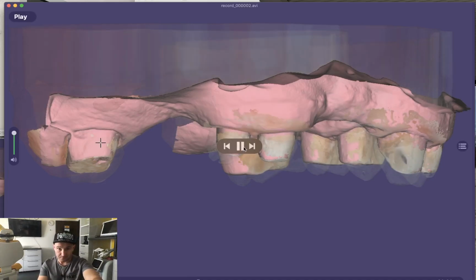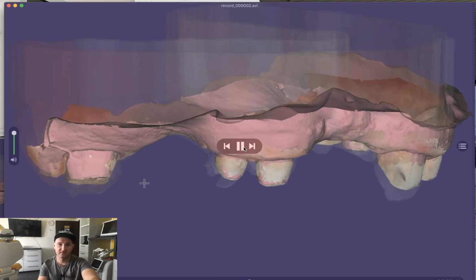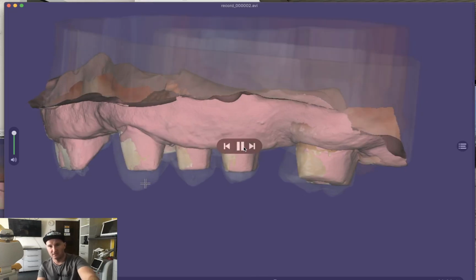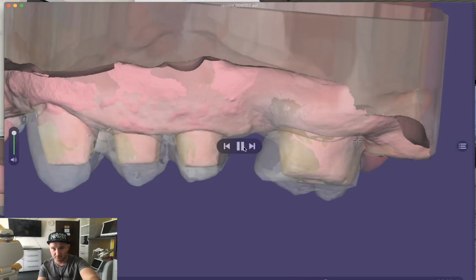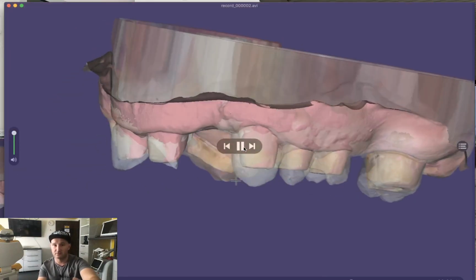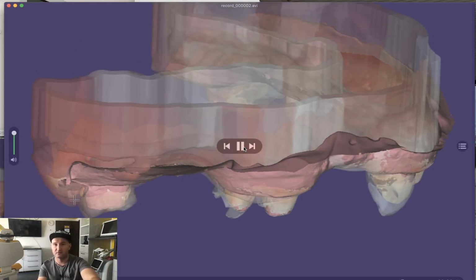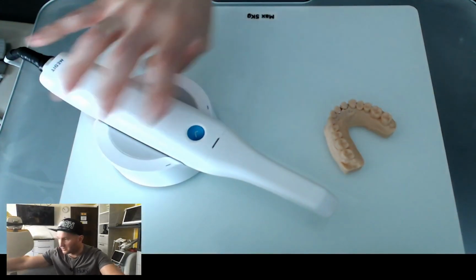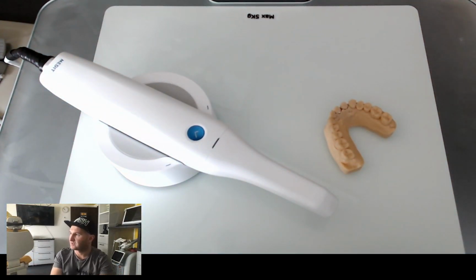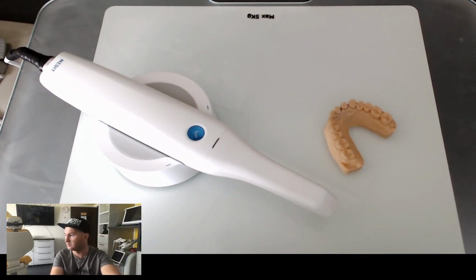So this is what I'm going to show you on today's Dentinar: how to properly scan teeth to get a correct result, which is similar to the result that you get when you do the impression. And very important in this is how you move your scanner, and I will show it to you on the next movie.